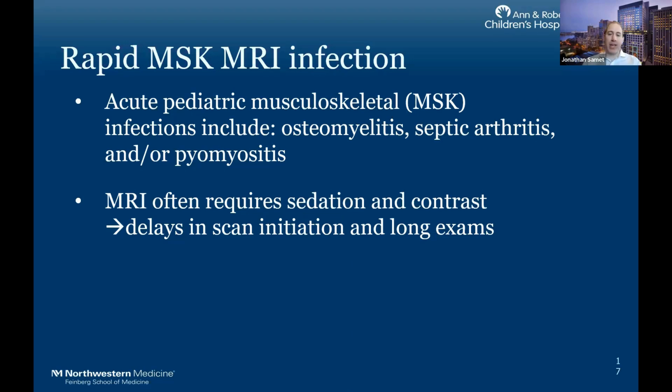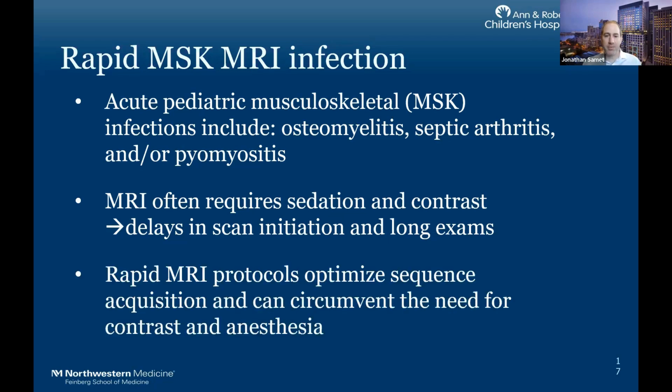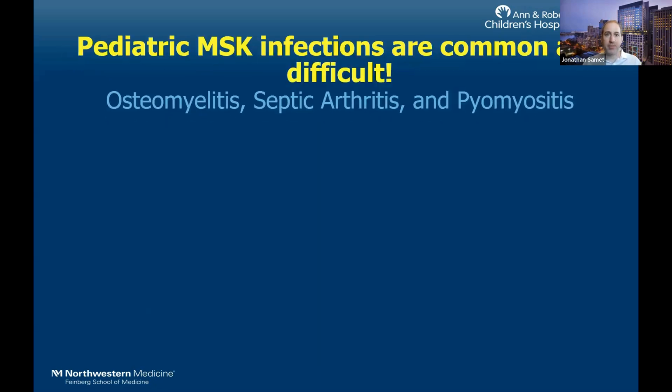We would have patients who are NPO, not eating for multiple hours. They get admitted. They're waiting for their MRI, waiting for the anesthesia team. There's long exams. Sometimes I'd call and say, "Are you done yet? Are you done yet?" And they're going on and on with these exams. The rapid MRI protocols can optimize the sequence acquisition and can circumvent the need for contrast and anesthesia.